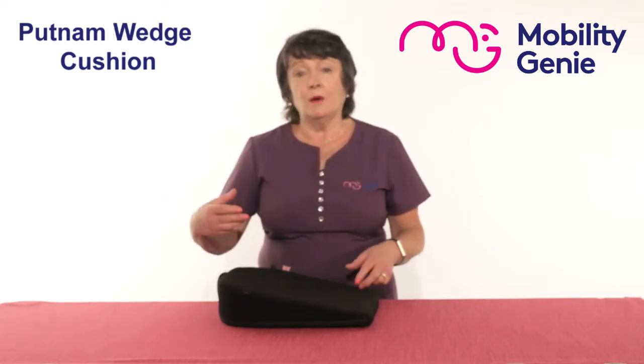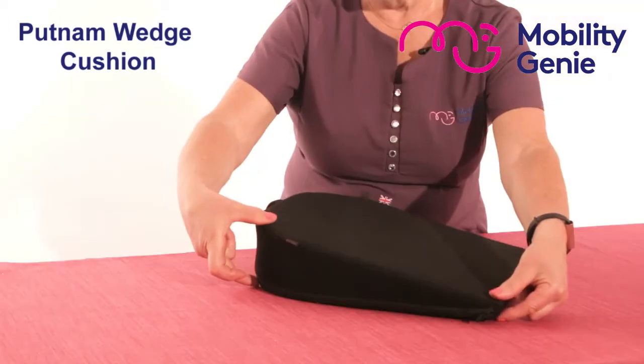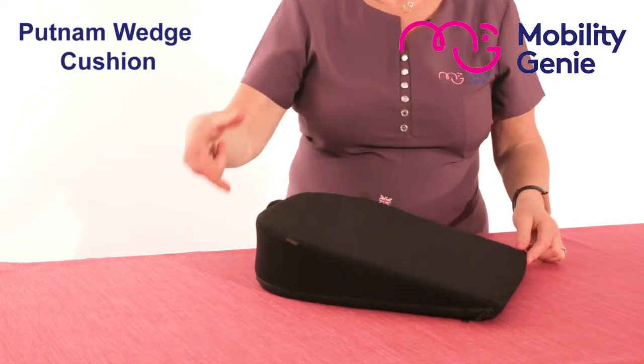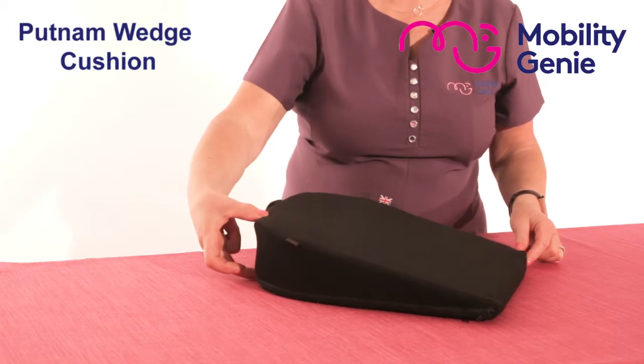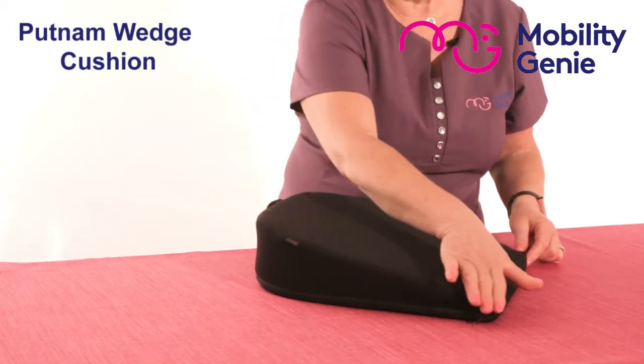At Mobility Genie we recommend the Putnam range of cushions. This is a wedge cushion. A wedge by its nature is higher at the back than it is at the front. This is an 11 degree wedge, which has a height at the back of three and three-quarter inches and it slopes as it goes towards the front.